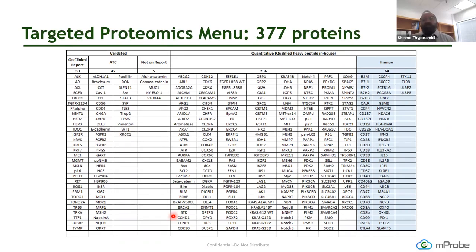Yes, definitely that tumor heterogeneity problem is there. Make no mistake about it, it's definitely there. But the way we try to avoid it is we just try to get an average of the tumor. The other experiment that I was describing is when you slice from one section to the next section, if you look at the same area, which is slide 1, slide 2, slide 3, it's actually pretty even. You don't see much difference, at least until you go to maybe the 20th or 30th section, but until then, you don't really see much difference.